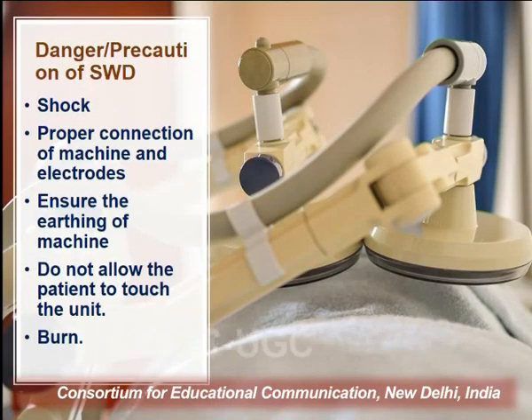Now, dangers or precautions of short wave diathermy. Proper connection of machines and electrodes. Ensure the earthing of the machine. Do not allow the patients to touch the unit or get burned.